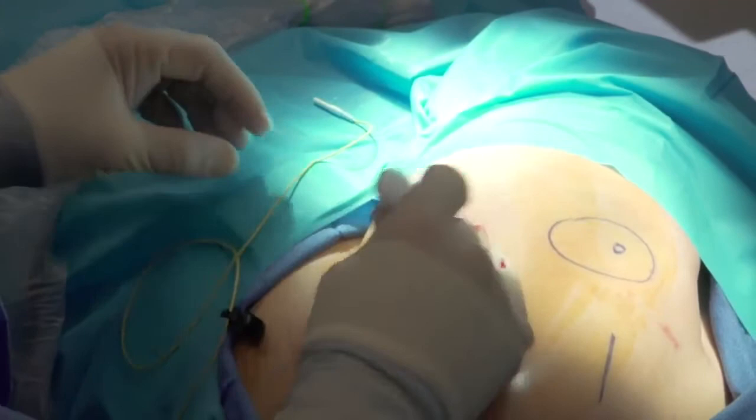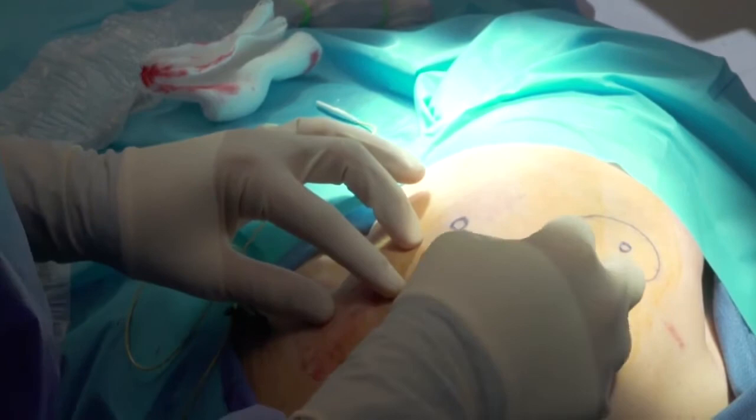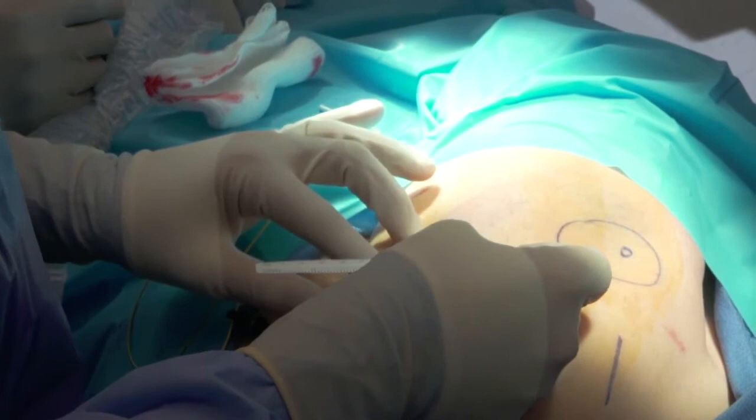Now what I need to do is measure this out to where I'd like it to end up, which is about there. What I would try to do is about 2 to 3 centimeters beyond the... I'm trying to get it further out just so we can get good contact of it, because his other shoulder's not that good.